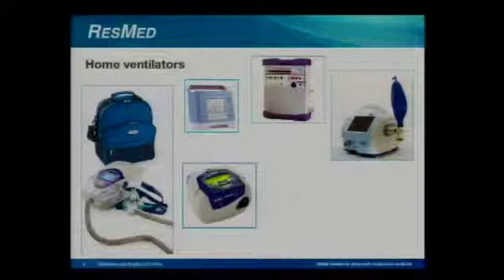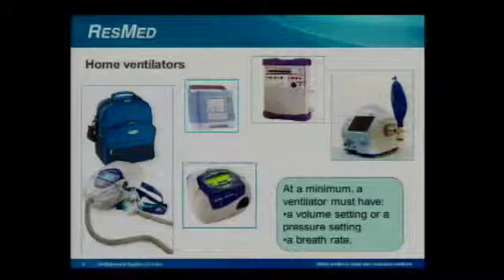Now the home vents, we're very fortunate. We have a number of wonderful new home ventilators out now, probably numbering around 10 different types. And the challenge is to find the one that's best for your particular situation. Each ventilator has some special modes or some special features that may or may not be appropriate for your situation. At a minimum, a ventilator needs to have a volume or a pressure setting and also a breath rate. We want to be able to set that breath rate in case the patient isn't taking those breaths on his or her own.